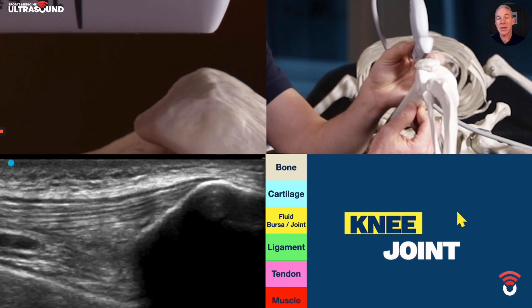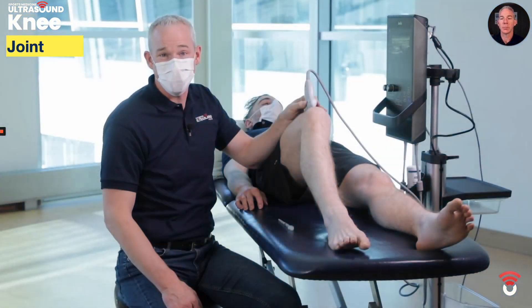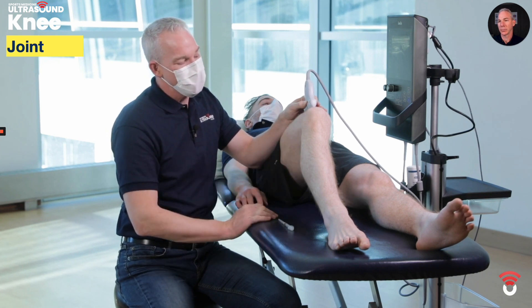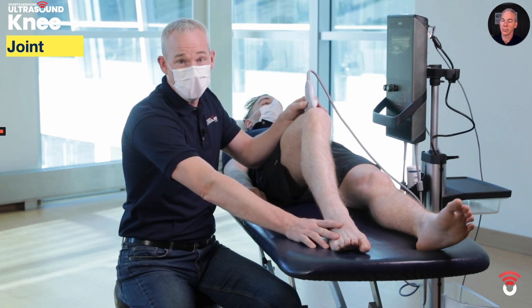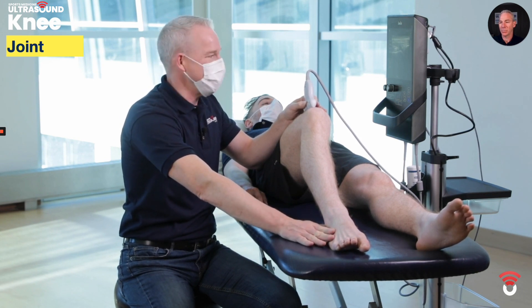Okay, time to see what it's like in a live model. I'm going to show you how to scan and inject the knee joint using ultrasound. I've already got my patient positioned at approximately 30 to 40 degrees of flexion. You might need a large bolster, and you definitely need a non-sock-wearing foot so it doesn't slide on the exam table.